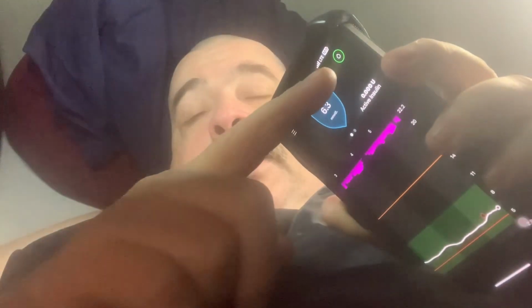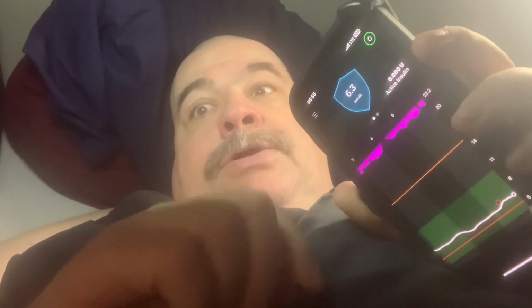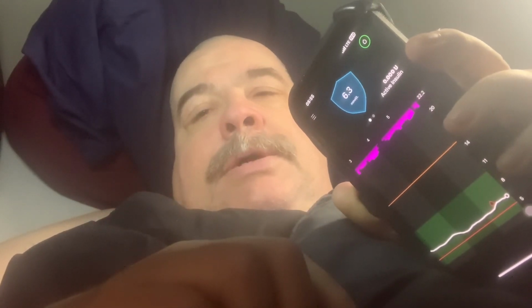Current blood sugar is 6.3. Not going to spend an awful long time on this today, as I just did the previous video. Been pretty stable. It came down here showing 5.9 earlier. I'm up around 6.3 now. I have calibrated now. Before I didn't calibrate, and it had gone into the warning symbols. Blood sugar overall, it got up a bit.